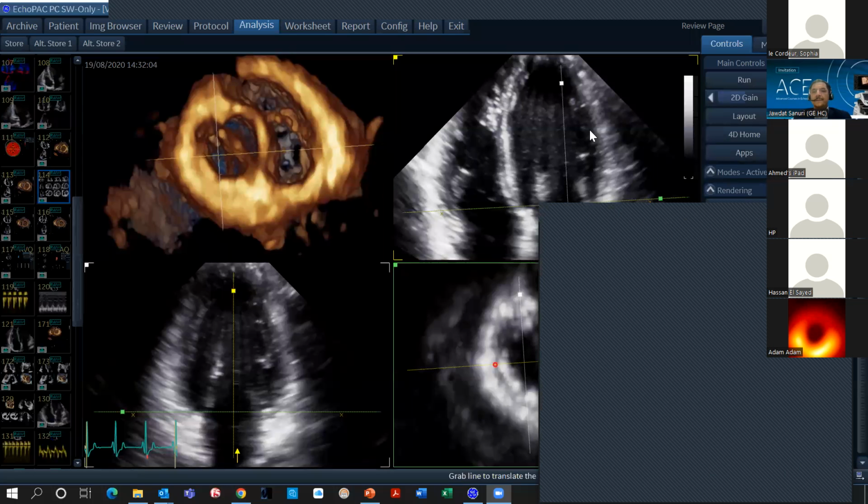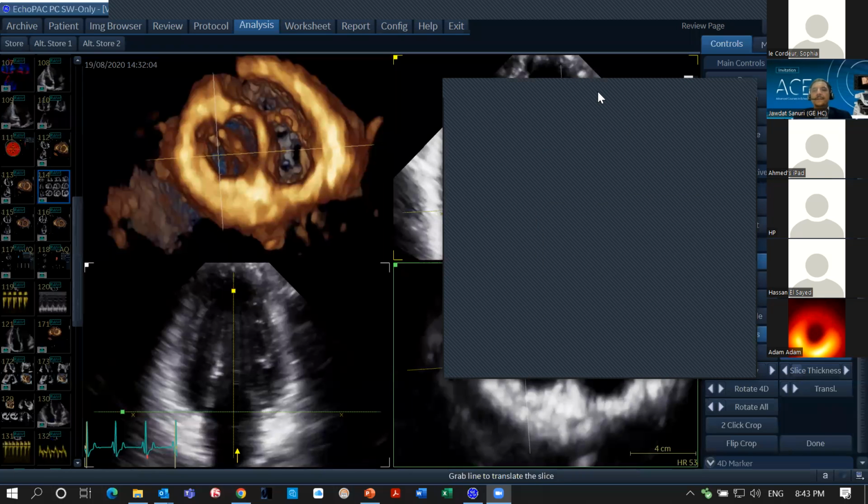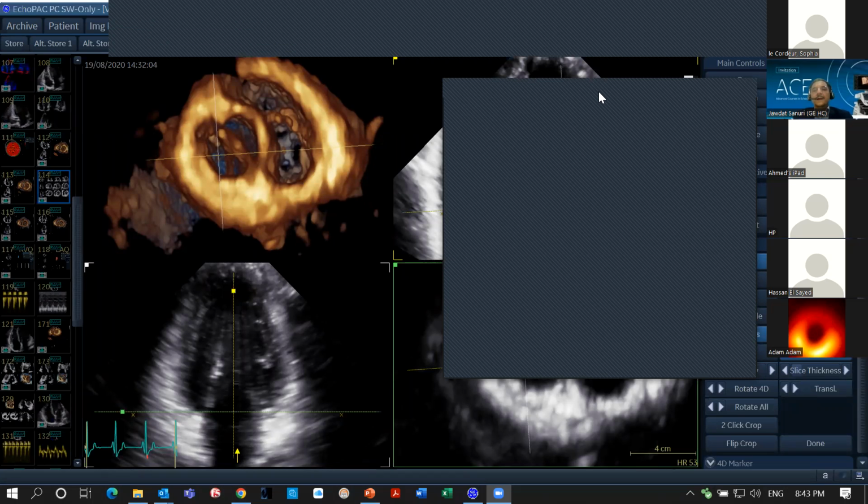The accurate measurements for the mitral valve, tricuspid valve, or even aortic valve are from TEE, not from transthoracic echocardiography. So the measurements or reference values from transthoracic echo are validated if we have a good picture. Yes, the method is validated. There has been a lot of literature and studies.